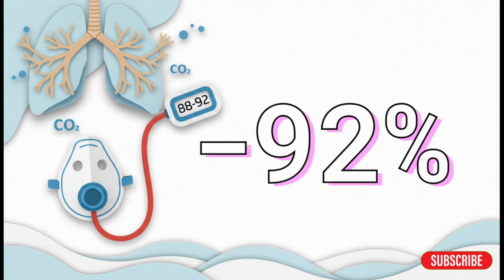Well, for a lot of patients with COPD who are known to retain CO2, our goal for their oxygen saturation is actually a bit lower. We're usually shooting for a target between 88 and 92%. And the reason is, giving them too much oxygen can actually knock out their drive to breathe. And this is exactly why that Venturi mask is so incredibly valuable. It lets us dial in just enough oxygen to hit that specific target without going overboard.